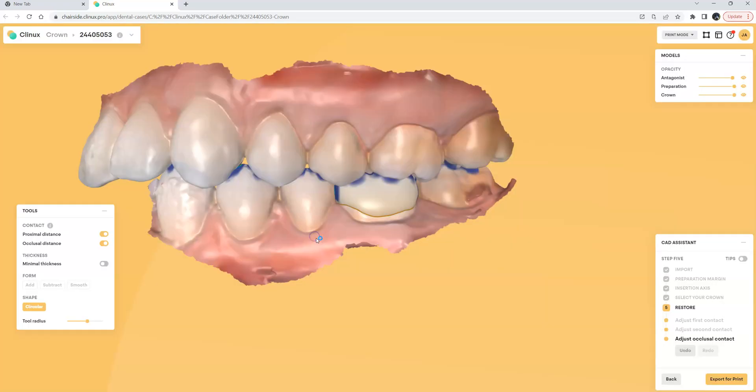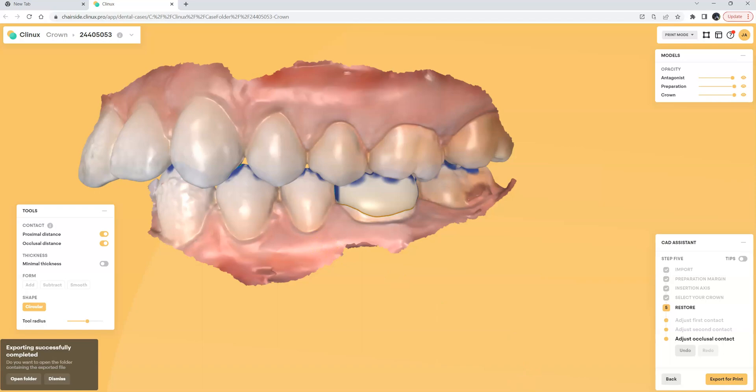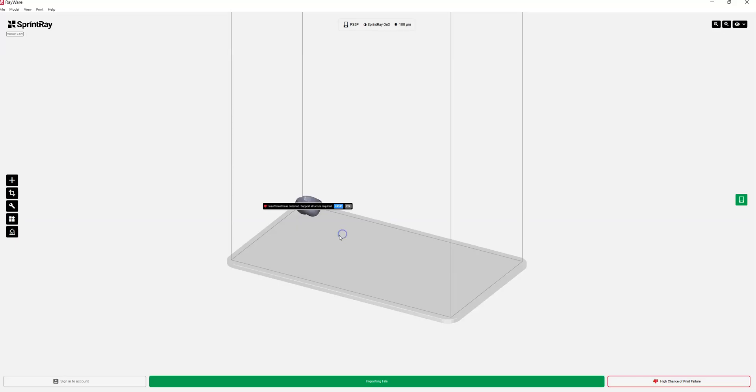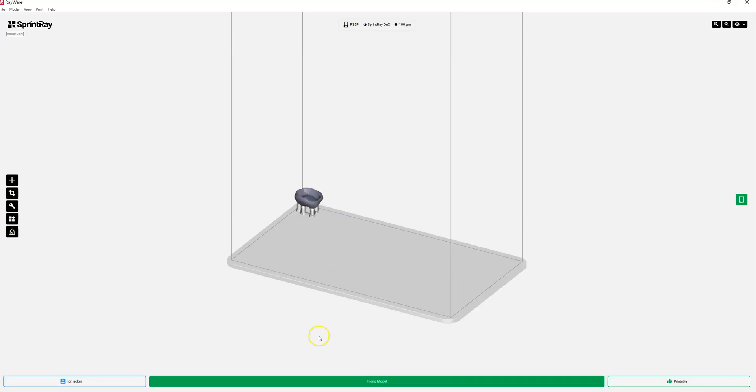I can go ahead and click export for RayWare. It'll automatically now export this file, it will automatically launch my RayWare software and it'll automatically bring the crown in upside down and ready for print.